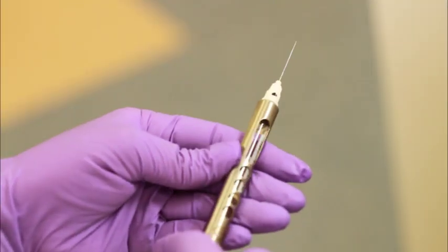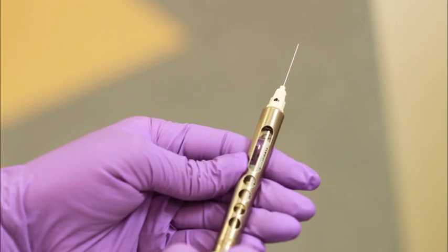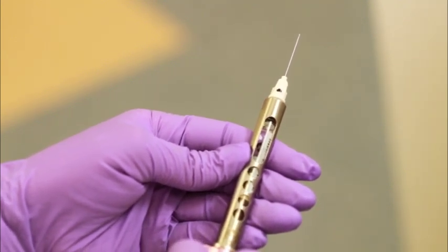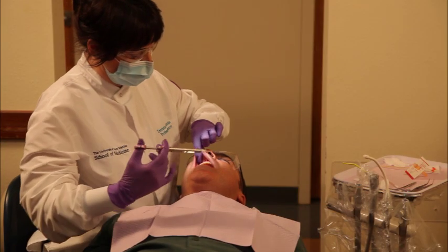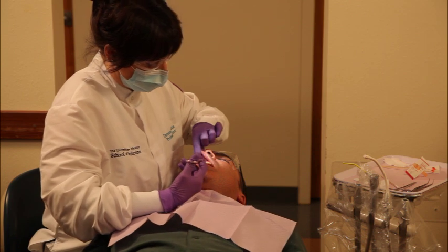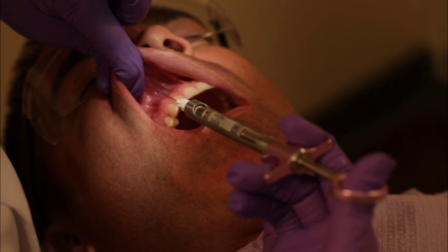Using a 27-gauge short needle with the syringe in the dominant hand, orient the bevel of the needle away from the large window of the syringe to ensure that the bevel orientation is toward the bone. Establish a fulcrum that allows you the greatest stability of the syringe. Place the syringe parallel with the long axis of the tooth, with the large window facing you.